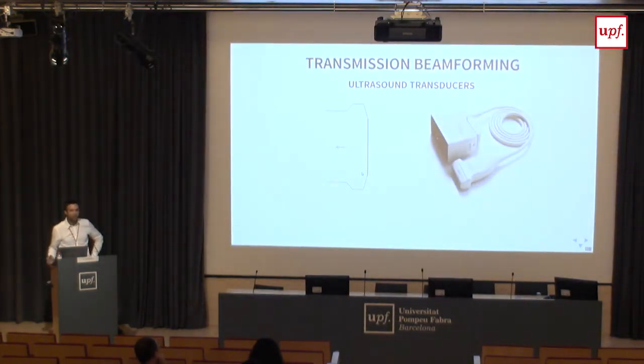So very briefly, ultrasound is acquired with an ultrasound transducer, which looks like the picture on the right. And for my diagrams, I represent this as the diagram on the left. So it's a collection of piezoelectric crystals. These are the little squares on the surface.